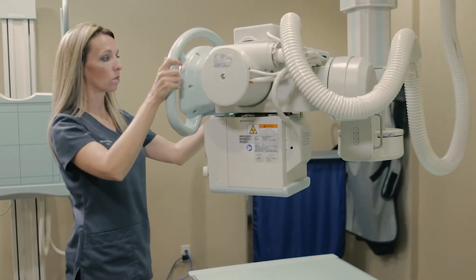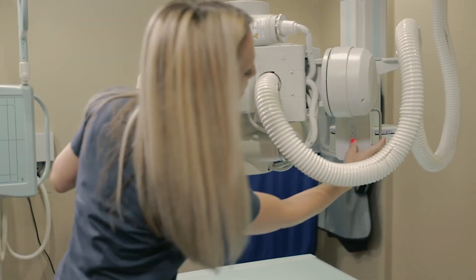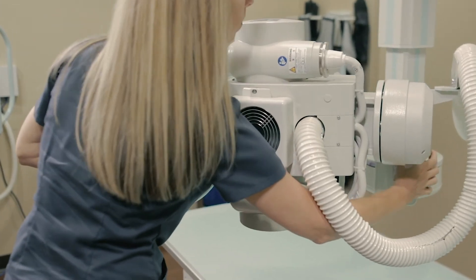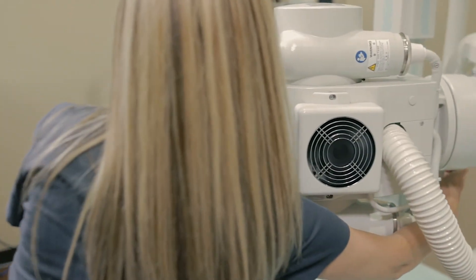The rear-mounted switches, located on the back of the overhead tube, allow for vertical access and rotation in any direction. With the addition of the collimator light switch, these extra buttons ensure the versatility needed to complete any emergency exam or cross-table work.